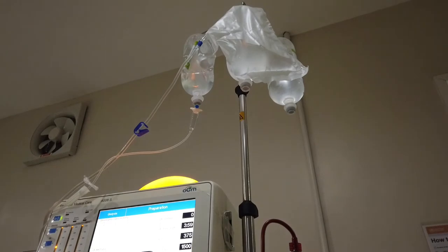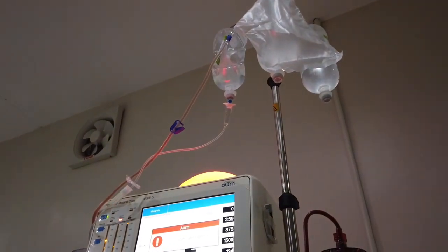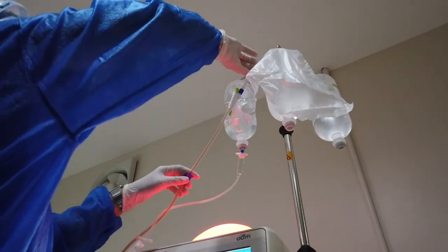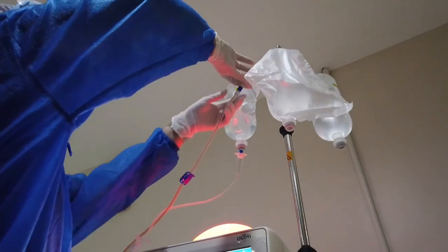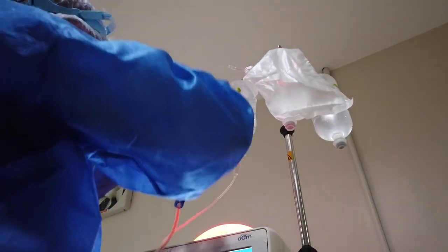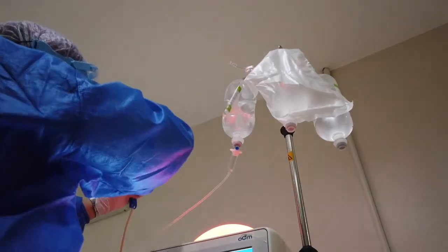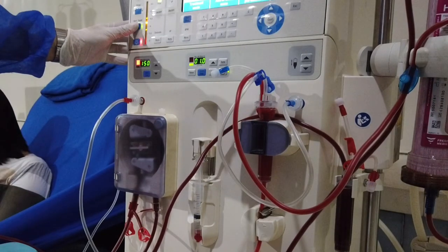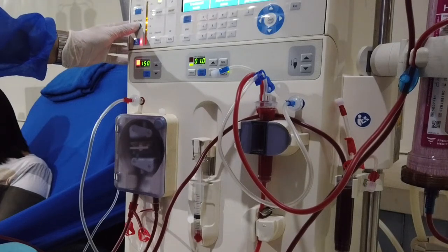The machine will alarm once blood reaches the venous line. Dis-alarm it. Close the big blue clamp and the drainage bag clamp, then disconnect. Connect to the patient side, then open both clamps of the needle side and the venous line. Click start or reset and the blood pump is automatically activated.